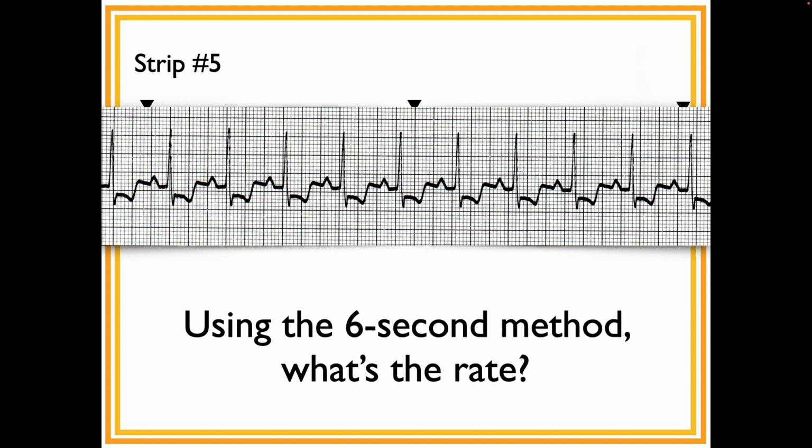Ours is a little different. Oh, do you have a different one there? Our last QRS is inside of that line on our page. Mine looks exactly the same. Yeah, you guys are smoking. It's 95 to 100, okay? We said that it'd be 95, because we're learning it right now, and if yours looks different, but that's like one.